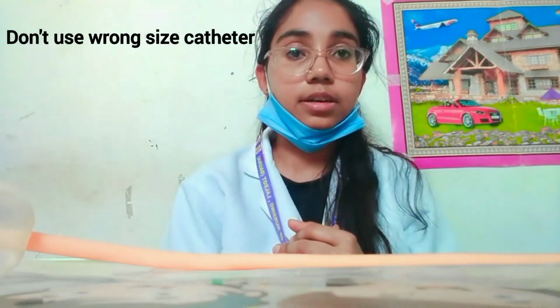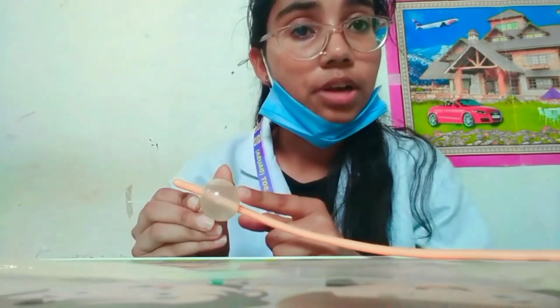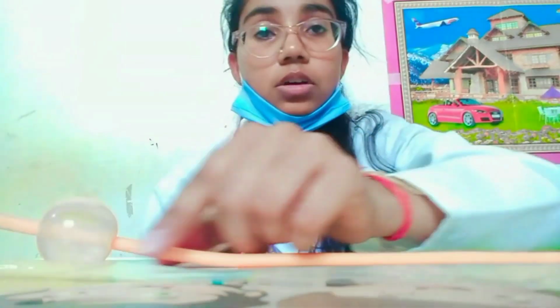Don't use the wrong size catheter. After that, don't inflate the balloon beyond its limit. Its limit is only 30 ml, or 10 ml in some urinary catheters. Okay. And don't forget documenting the procedure, date and time.